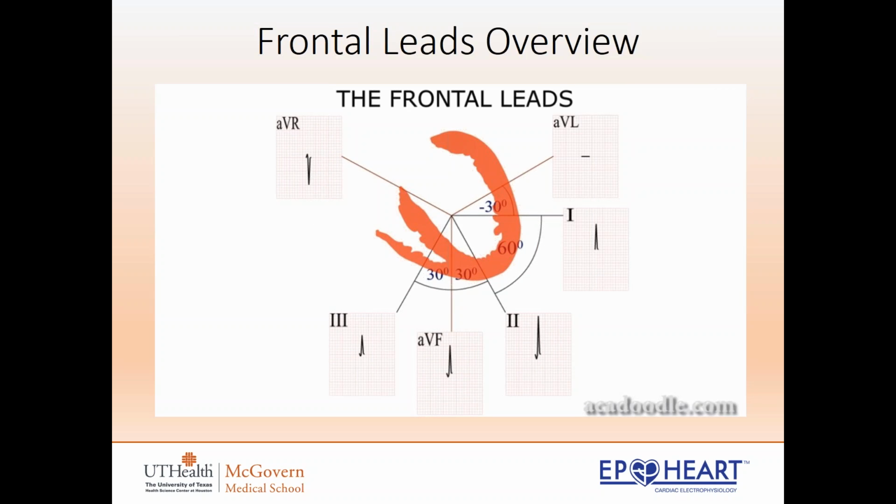As we've seen with the chest leads, cardiac repolarization takes place in the opposite direction to the depolarization wave. So the T waves in the frontal leads also tend to be concordant with the QRS complexes.